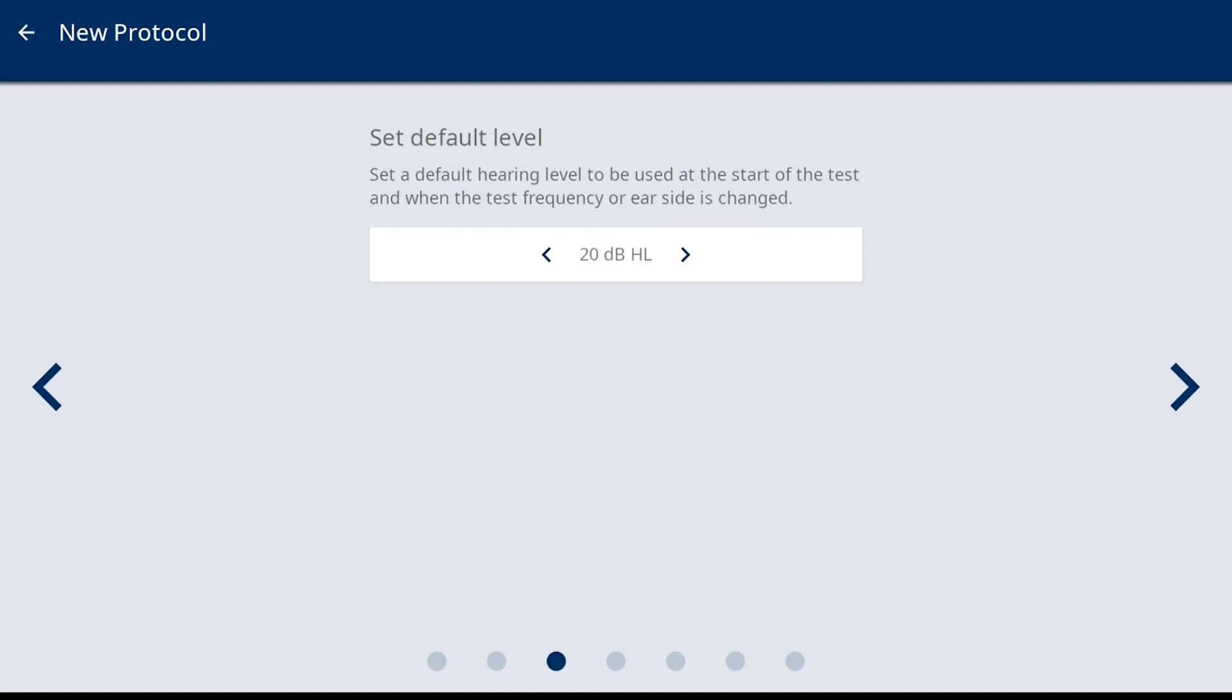Set Default Level is next. This is the default hearing level the audiometer is set to when entering the test screen, when changing frequencies and changing ears. Use the arrows beside the level shown to make a change.